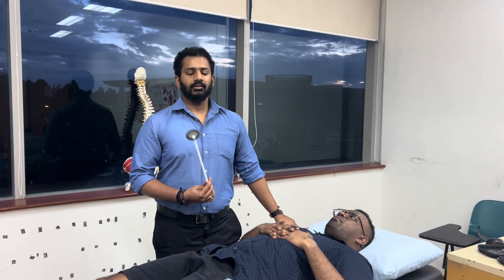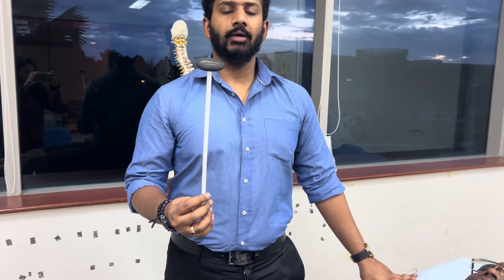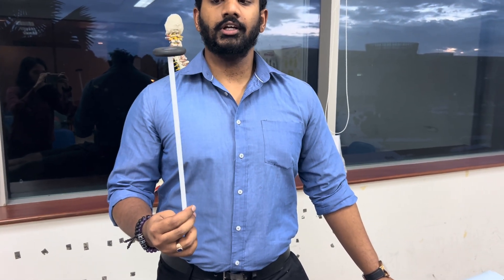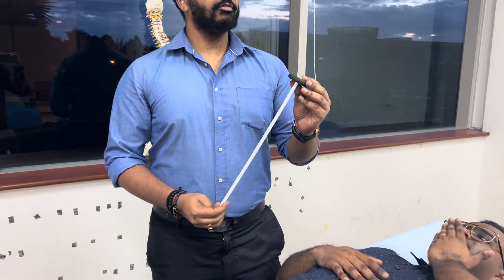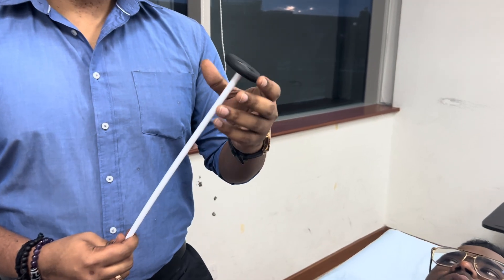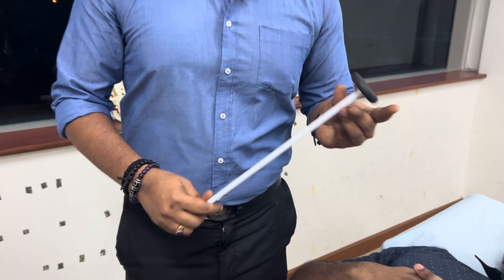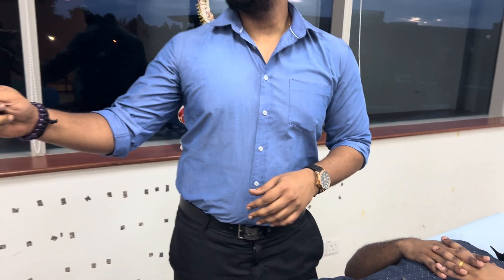Today we'll be looking at the technique to elicit the patellar and ankle reflex. This is the tendon hammer that we use — make sure that you obtain an adult-sized tendon hammer, not a pediatric equivalent. The device has a cushioned mass to absorb shock and a long rod. We hold it at the tip of the rod, not in close proximity to the head.